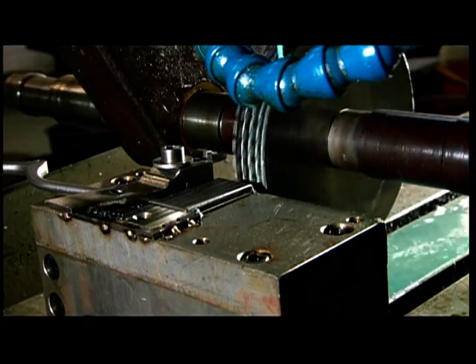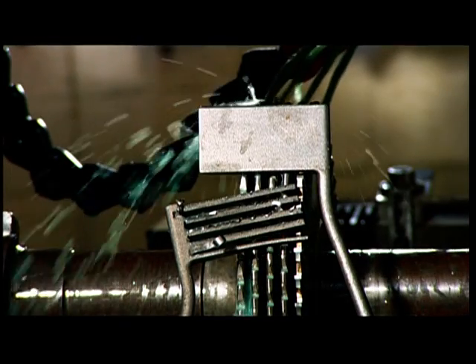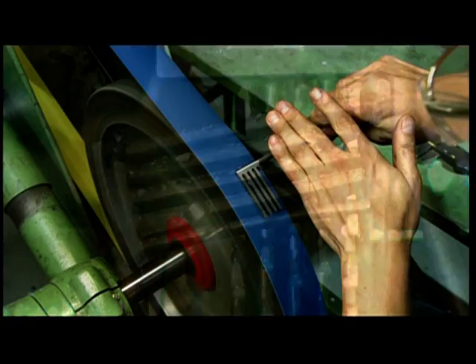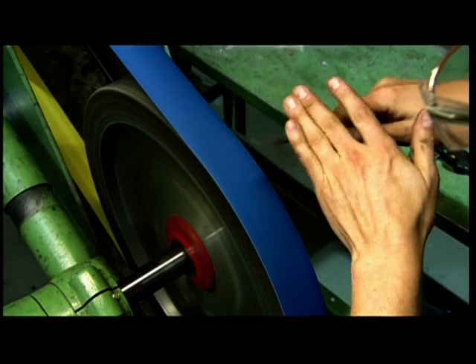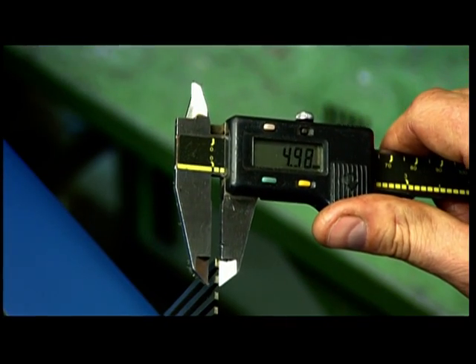Next, cutters carve slots in two parts to create the retractor's intermeshing jaws. These jaws will be used to grasp and retract body tissue so the surgeon can operate. A technician sands the teeth down to a precise size. He must be accurate within 1/4 millimeter.